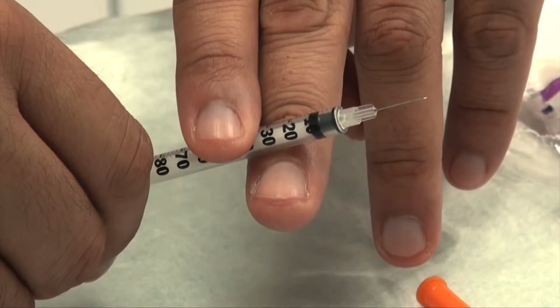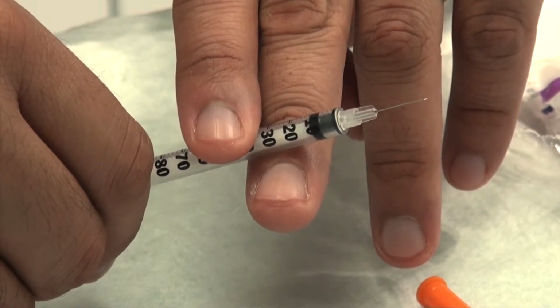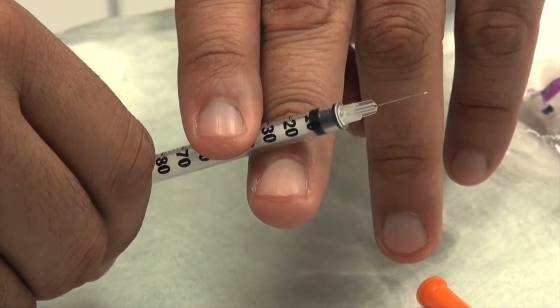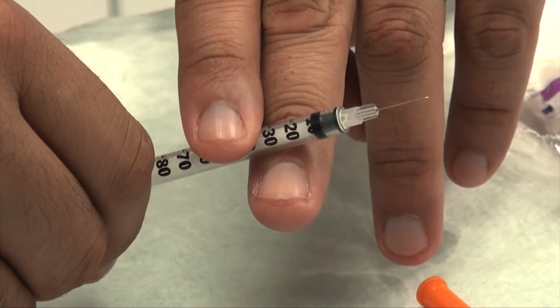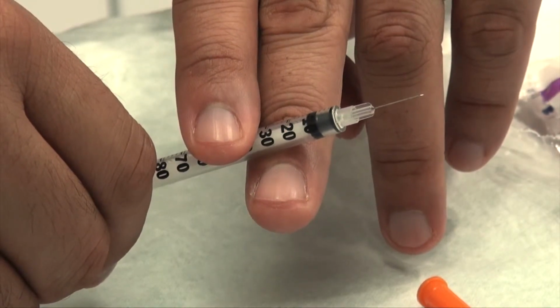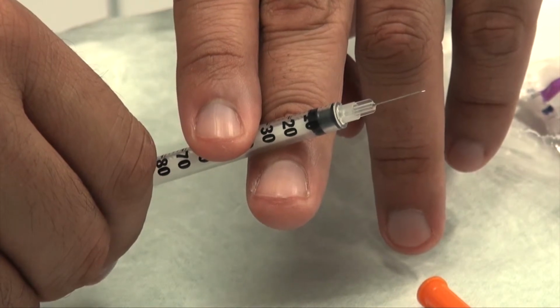After a while, even a 29 gauge or definitely a 30 gauge needle will lose its edge. If you continue using the same needle for a longer period of time, then the client will feel more discomfort. As a result, my practice is to change syringe once one area is complete, hence preserving the edge of the needle and minimizing discomfort to the client.